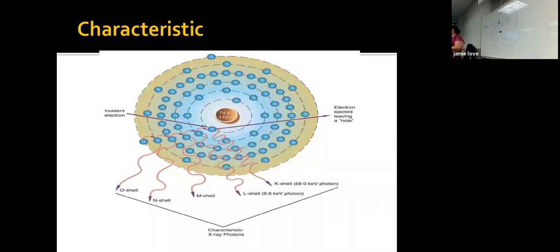This is one electron hitting an atom. This is an atom in the tungsten metal. These are the atoms, the atomic level of the tungsten that we're hitting. So when this photon's coming out, it's going to come out in whatever angle. It depends on which way it was going to go, whether it comes down through the port window or up and gets absorbed into the lead.